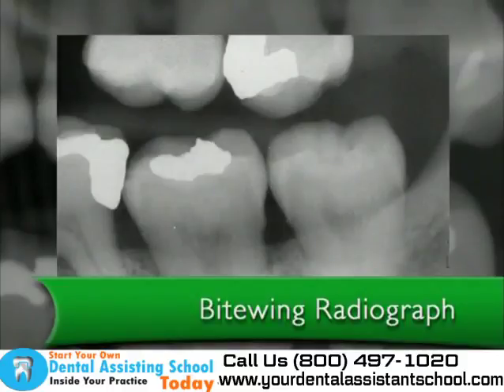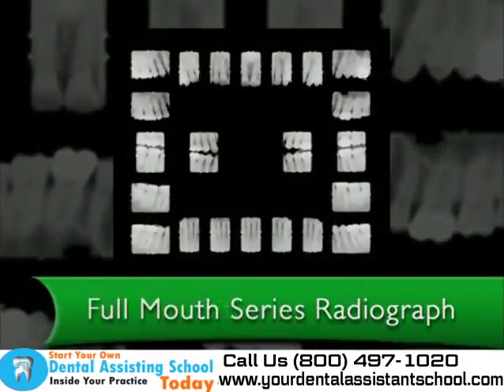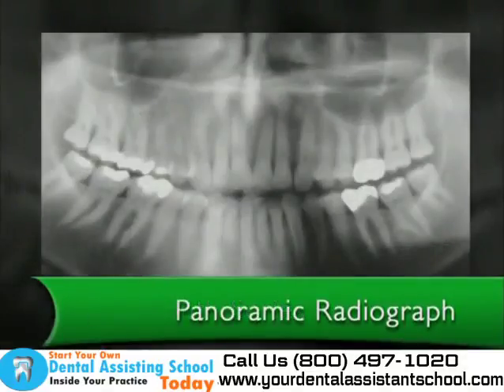It is often used since it is an excellent aid in detecting cavities between the teeth. The film comes in a variety of sizes. The full mouth series radiograph combines the bite wing and periapical radiographs, displaying all of the teeth, the roots, and the surrounding structures. The panoramic radiograph displays all of the teeth and much of the jaw and bone structure. It is rectangular in shape and is typically 12 inches long by 5 inches high.